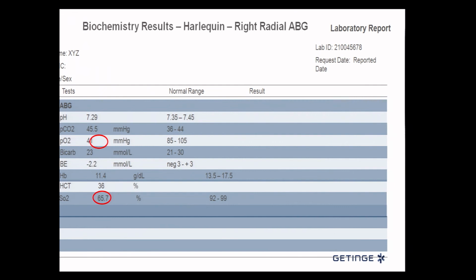It may be right, it may be wrong. Or in that case, if you have only femoral artery, it may falsely show always a very good number. Even if you are on very low flows, you'll see that femoral artery PO2 will be 300, 400 like that. Can we proceed further? So in this case, we had a right radial ABG.